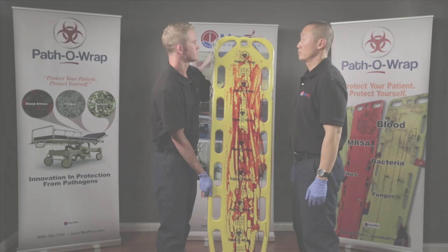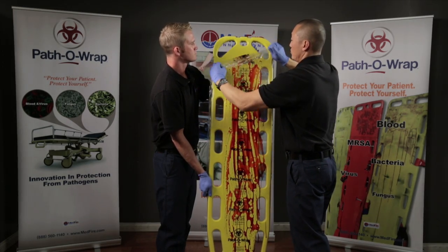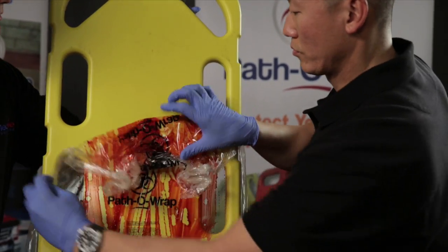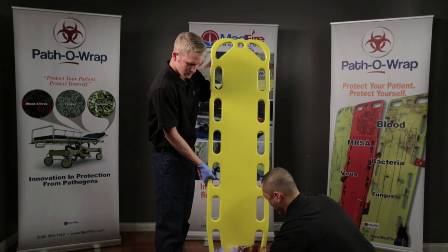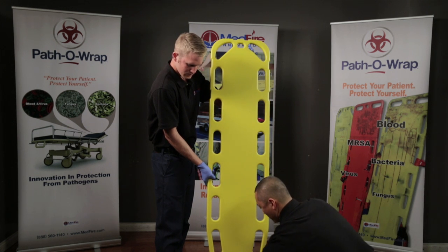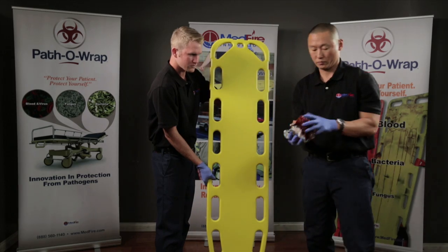Grab and pull an edge of the Pathorap film from the head or the foot of the backboard. Roll the used Pathorap film down and inward, making a ball, thus capturing potentially harmful pathogens at the same time. Once the Pathorap is fully removed after use, place the used wrap in an appropriate medical waste container for disposal.